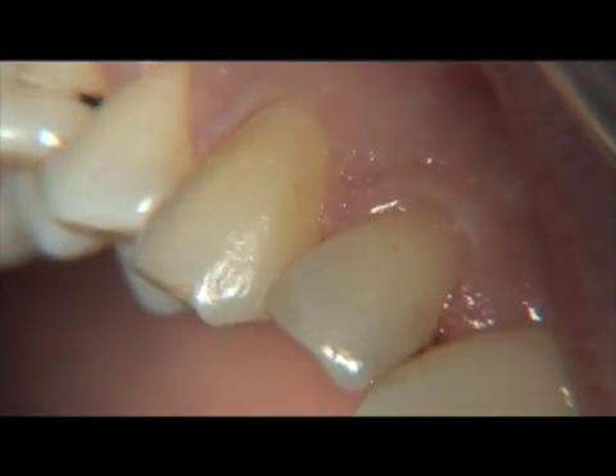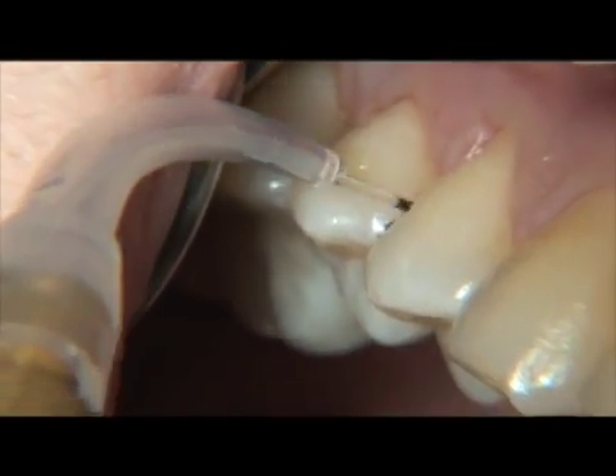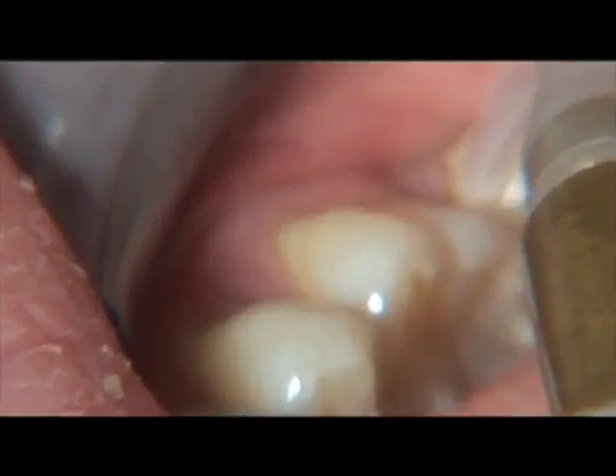The laser is set in a continuous mode of operation with a power setting of 0.4 to 0.6 watts. Remember that the fiber must be initiated for laser curettage.